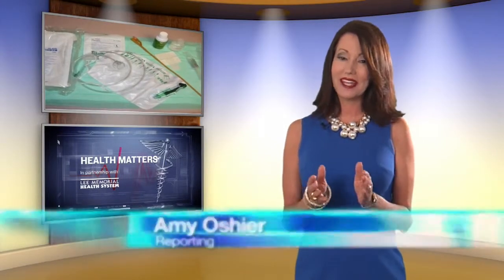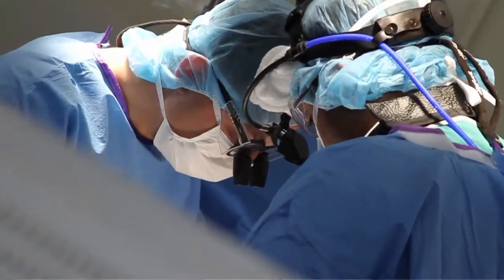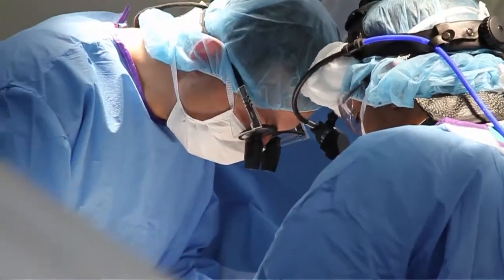Advancements in equipment that made catheters smaller opened up a new direction. Today, many doctors find a benefit in going through a small artery in the wrist. They can accomplish the same goals with less trauma. Some studies have looked at the bleeding risk utilizing that approach, and in centers where there's a lot of experience with this, they can actually reduce the risk of bleeding because the artery is closer to the surface and it's a little easier for the staff to help secure and make certain that any bleeding has stopped, as opposed to a deeper artery in the leg.